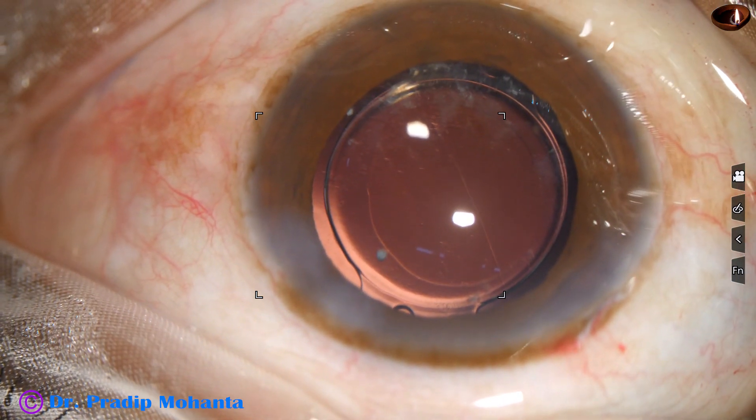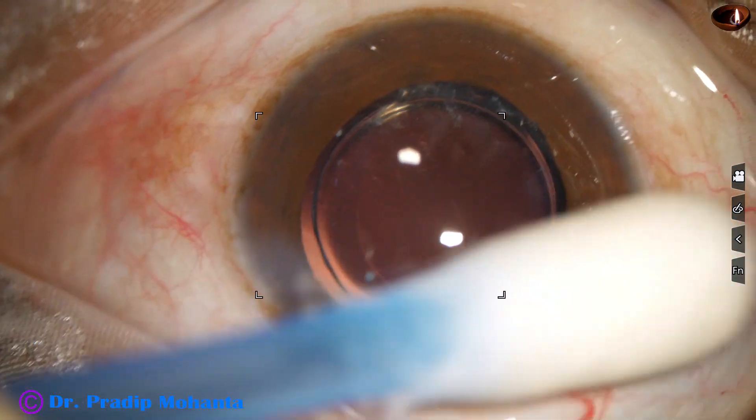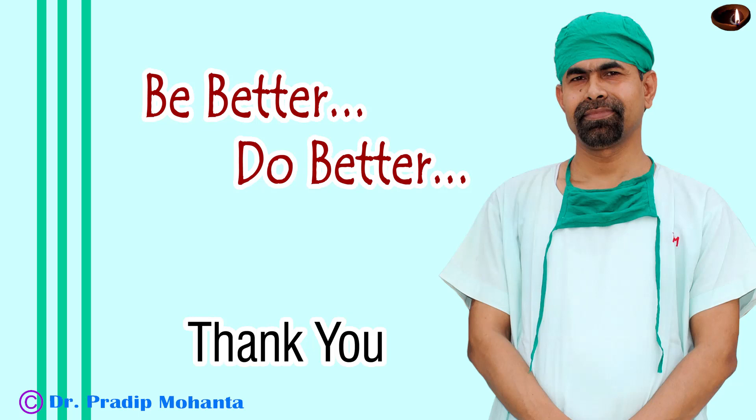The anterior chamber is nicely formed. The integrity of all the wounds is checked, intraocular pressure is checked, and the case is concluded. Thank you very much for your attention.